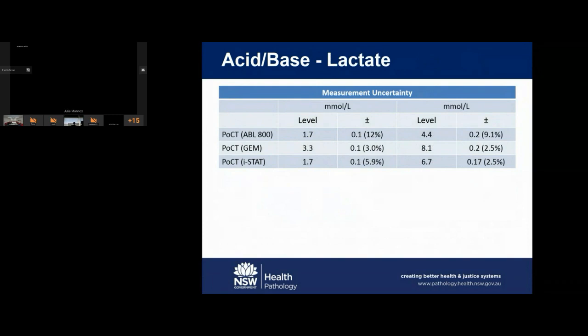Lactate, so we're moving more into the chemistries now. While still very unstable pre-analytically, it's not sufficient to show up between the delivery systems to these three blood gas machines. And as you can see, all very similar precisions, all producing very similar results.